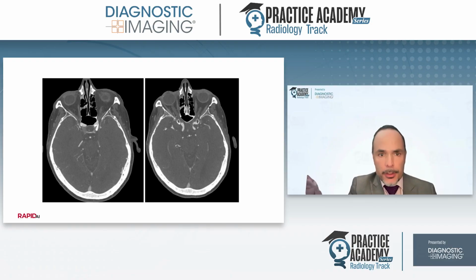For those unfamiliar, these are two transverse CTA source images in a patient who's had iodine administered, hence the bright vessels in this patient. This patient has bilateral aneurysms. These can be easy to miss. They can be easy to roll past on a busy workflow, or certainly when there are the additional interruptions and challenges of a busy call shift, for example. And in this location near the skull base, even typical 3D rendering tools can fail to remove the bone in a way that doesn't corrupt or contaminate investigation of the vasculature.